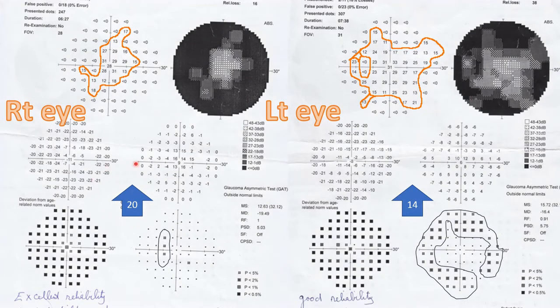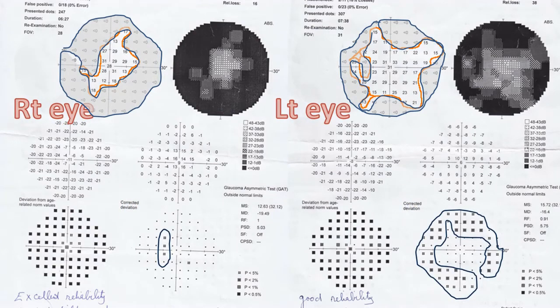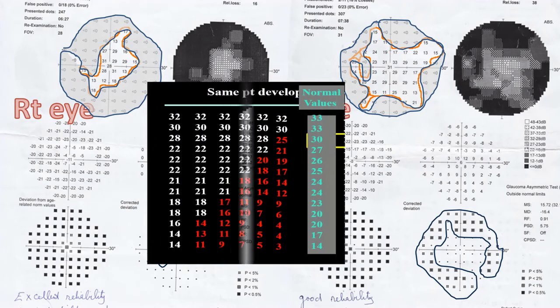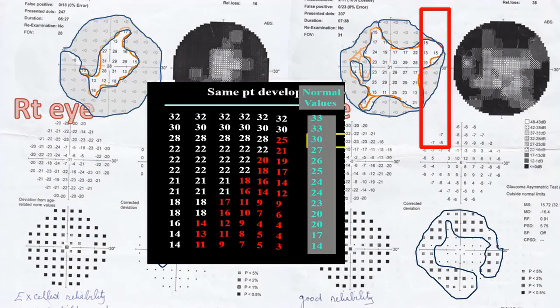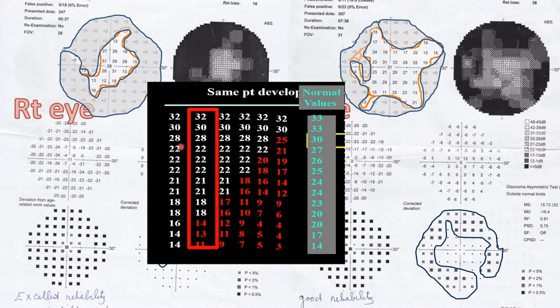So why was this extra adjustment done? Because the locations here with the 0 value are many, so that the area 85% was also included. For the left eye, the areas with 0 value are still down here, and the location 85% is not affected.